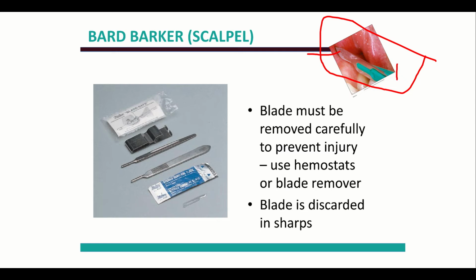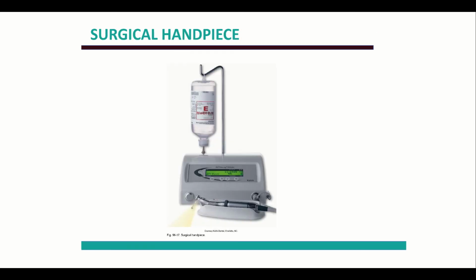a disposable scalpel on a disposable handle, and you just throw the whole thing away when you're done, or you can use metal ones where you slide the blade right onto this end of the holder for the needle and use it. And then this right here is a remover, so it helps you remove that scalpel blade from this metal handle that we're going to sterilize without hurting yourself.